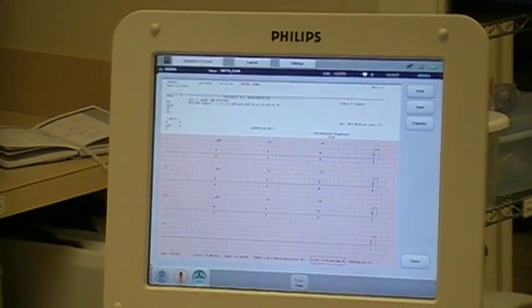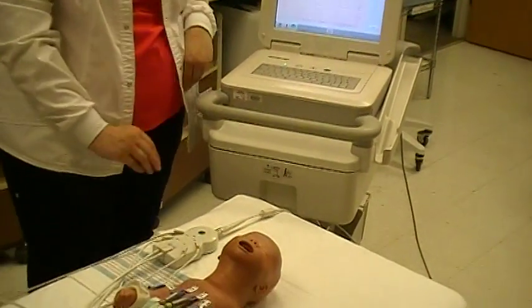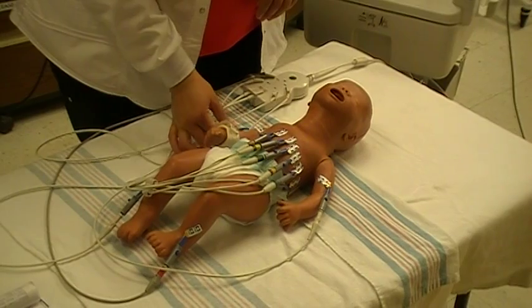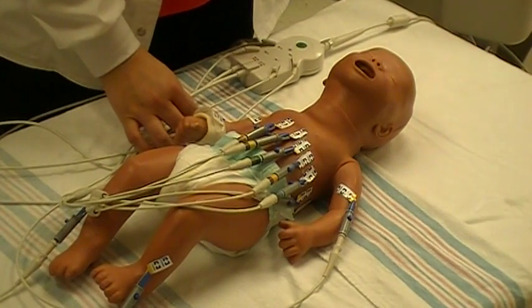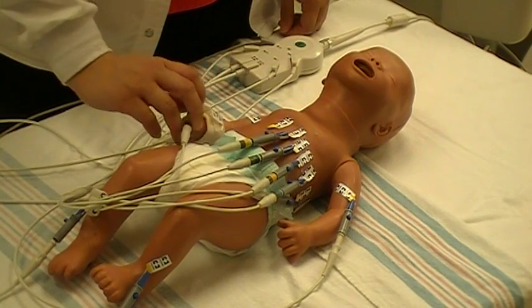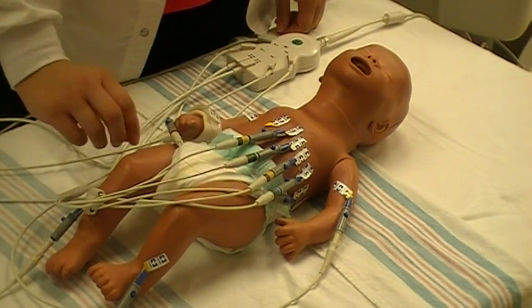Once the EKG has been obtained, you can take the leads off the patient. If the patient is going to need serial EKGs, we recommend that the leads be left in place. The 12-lead EKG leads themselves can be wiped with purple wipes in between patient use.